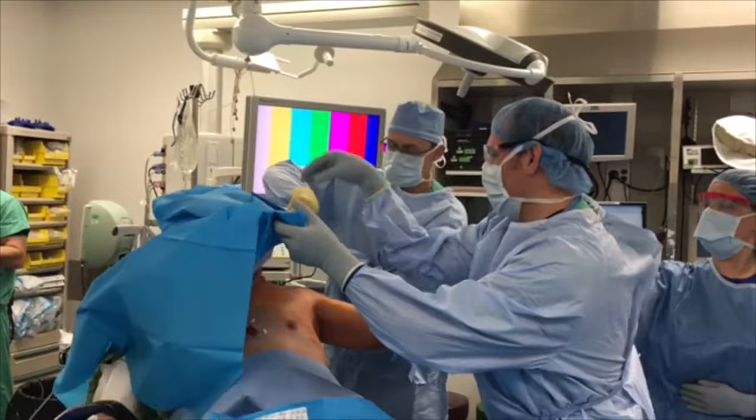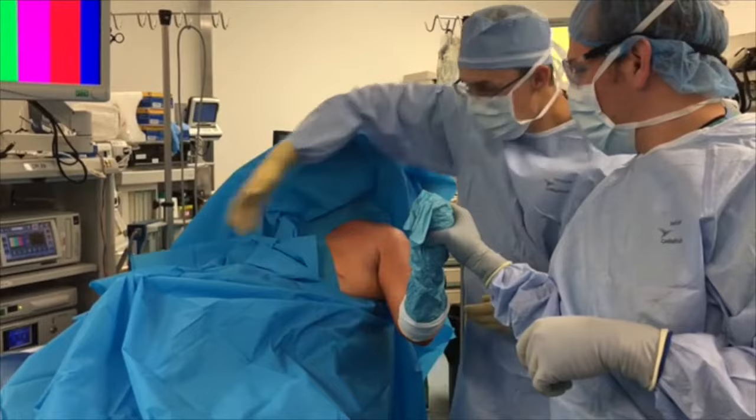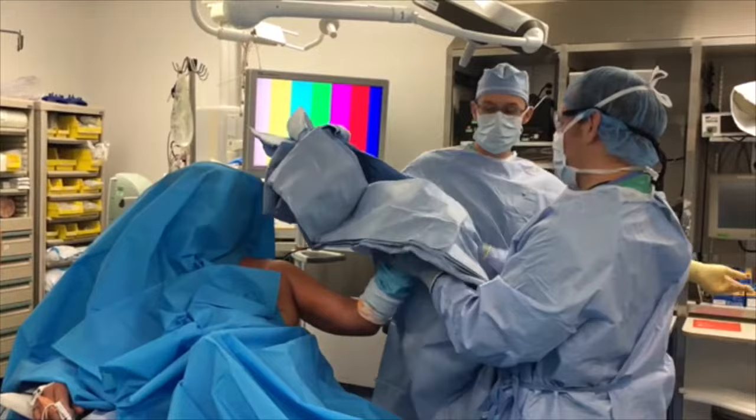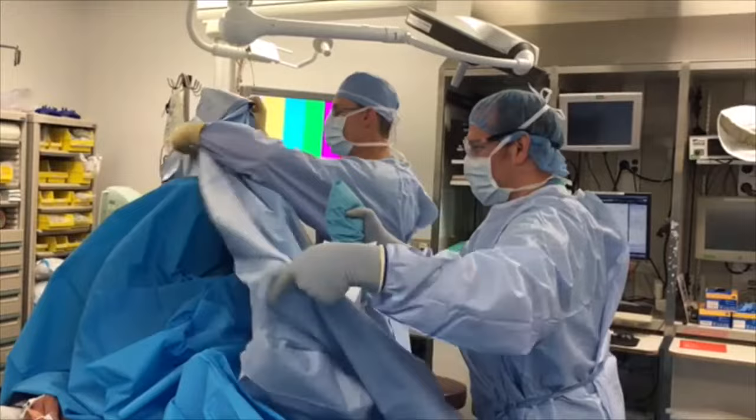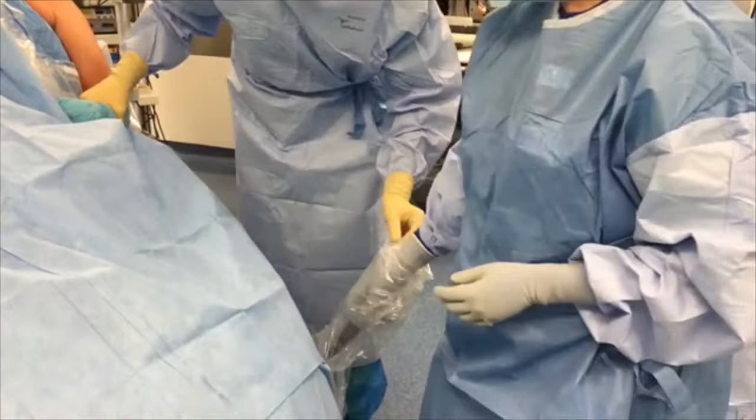At our institution we use two sterile blue u-drapes made by 3M Healthcare: one placed across the neck and down the chest and back, with the second being placed across the axilla and up the chest and back. The u-drape is folded at the point where they meet to avoid the operative extremity being pulled intraoperatively. A sterile shower curtain type drape with an arthroscopic fluid collection pocket and associated drain made by 3M Healthcare is then placed to isolate anesthesia from the operative field. A sterile connection to the Spider II limb positioner is then attached to the base with the sterile covering being pulled over the base.